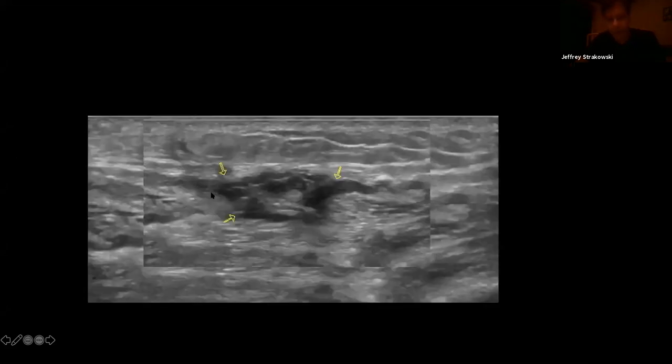Okay. This is where I do a lot of, have people raise hands and things like that. Obviously, we can't do that in this context in the Zoom. But this one is an example of a complete neurotmesis. Even though it's a neuroma like the last one we saw that actually still had some potential for function, when we see the loss of tension of the nerve, we know that it's completely separated and all this is hematoma and junk in the way. There's no viable nerve tissue here. So without some type of intervention, this one will not do well because it doesn't have adjoining connective tissue that's maintained any tension on the nerve endings, okay?